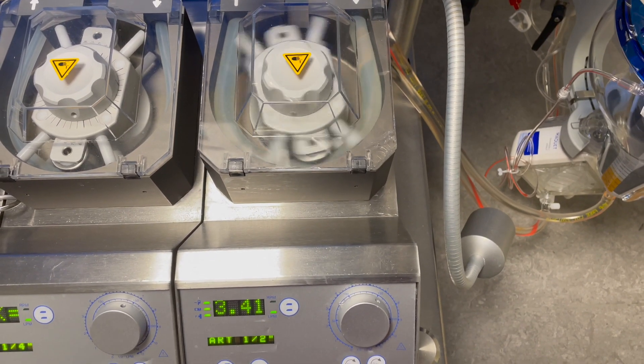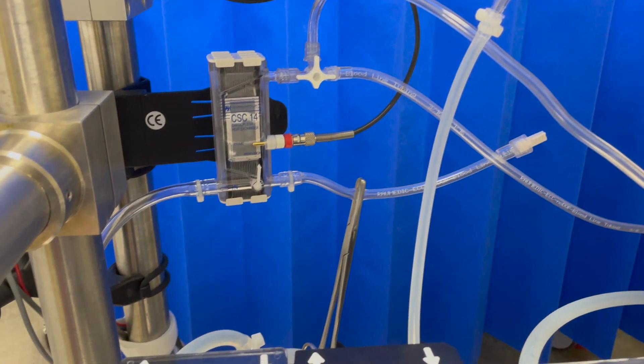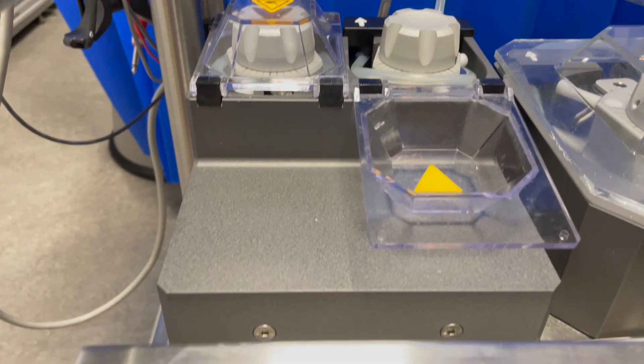Prime the oxygenator. Do not start the cardioplegia pump until the arterial pump is on. Once primed, move over to the cardioplegia side. Arterial pump flow must always exceed cardioplegia pump flow.